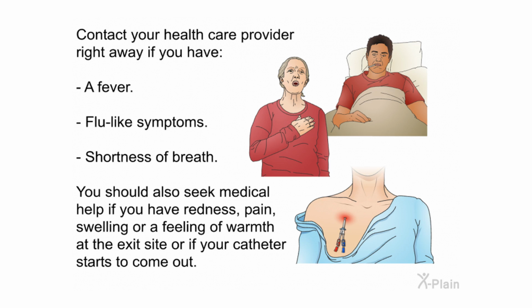Contact your healthcare provider right away if you have a fever, flu-like symptoms, shortness of breath. You should also seek medical help if you have redness, pain, swelling, or a feeling of warmth at the exit site, or if your catheter starts to come out.